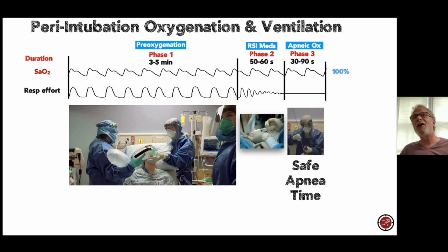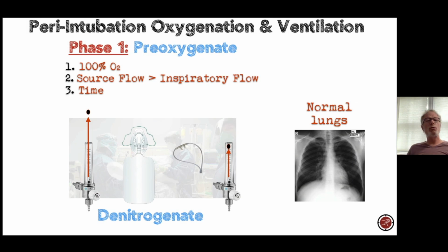During that period of time, we're going to still apply oxygen through nasal prongs. But the reason many patients aren't going to desaturate during that period is because it's uncomplicated and you're able to intubate quite quickly. So phase 1, just in summary, 100% FiO2.